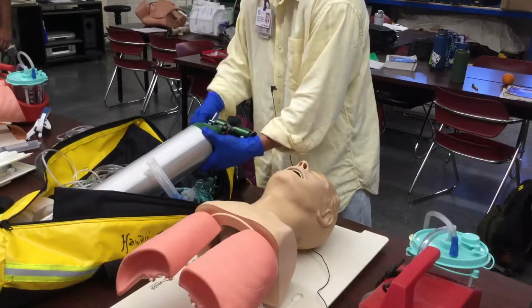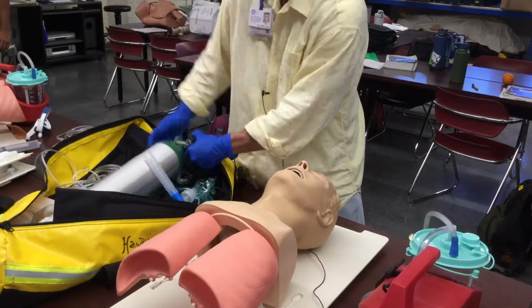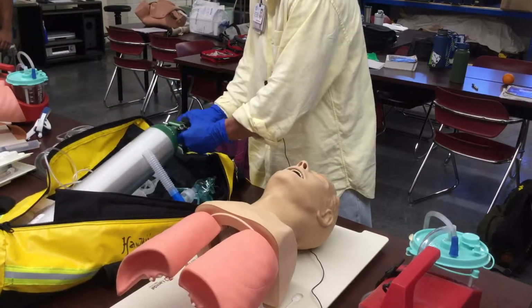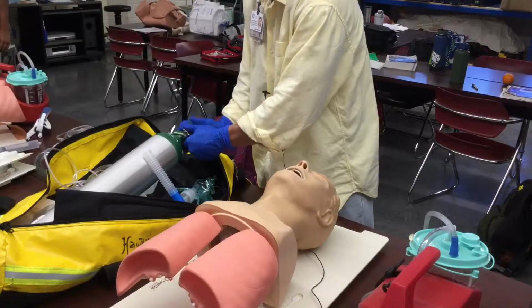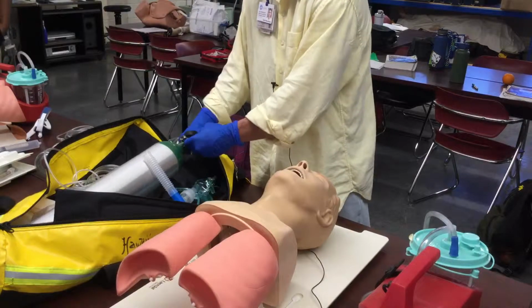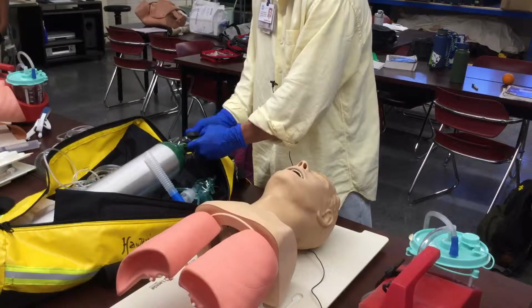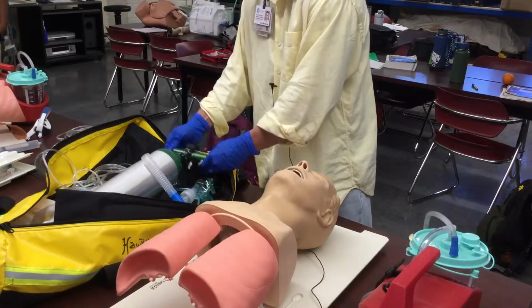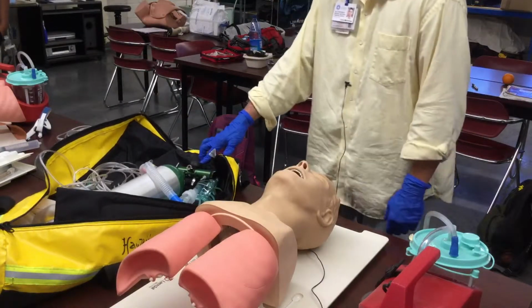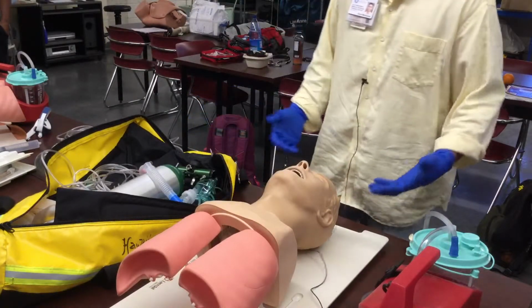As I look at my oxygen bag, I make sure that I have all my BLS adjuncts, my NPAs, OPAs, my passive flow devices such as a non-rebreather mask and nasal cannula in different sizes, a bag valve mask, and a nebulizer, one for the mask and one for the T-piece. So I go ahead and connect up my regulator. I open up the tank all the way, turn it back a quarter turn, making sure that my pressure gauge reads an adequate volume between 500 and 2000, and I don't have any leaks.